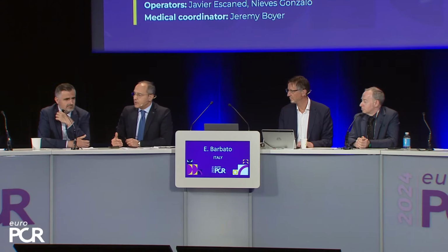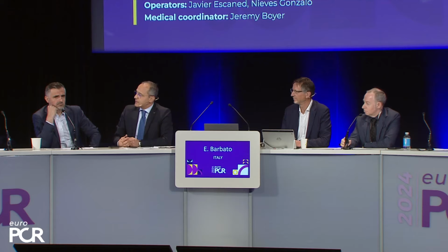Yeah, Peter is quite consistent. He says, I'll go for imaging, and depending upon imaging, I will decide the plaque modification tool I'm going to use. Let's assume you won't cross with your OCT or IVUS catheter and you are forced to do plaque modification first, what would be your choice here?